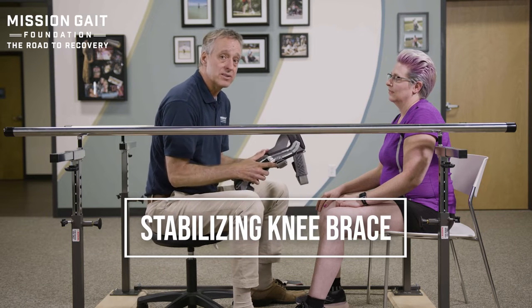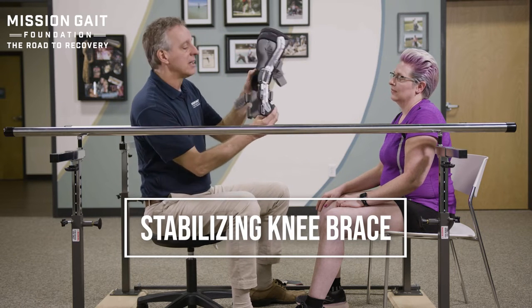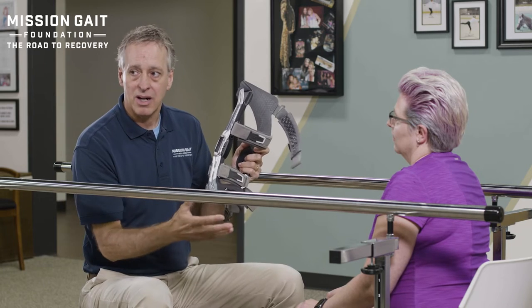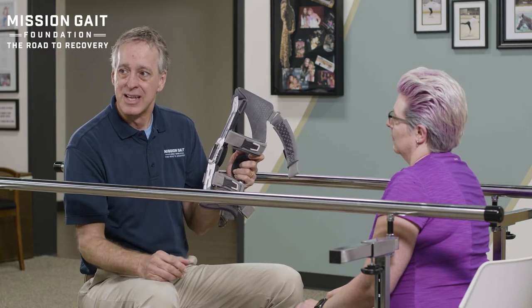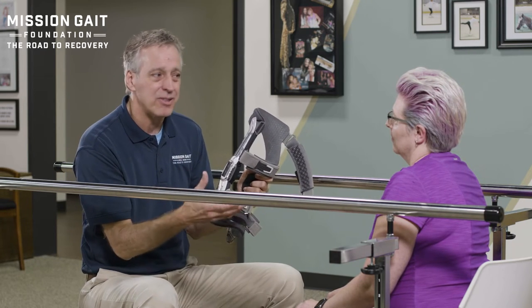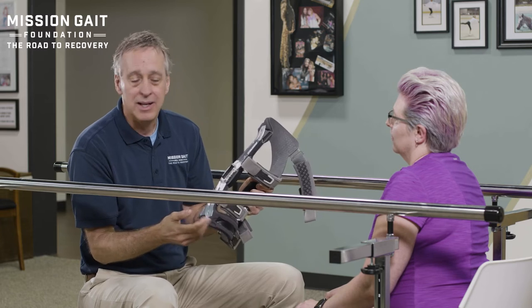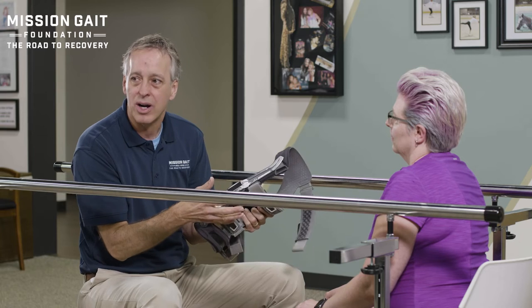We get started with first fitting the brace. In a frame brace — a very stabilizing brace with lots of straps — it can be somewhat confusing to the patient. I like to first explain the brace to them. We're not going to talk about product names here, but normally I would, because I want the patient to understand this isn't just a thing stuck on your leg. This is a brace you're going to be using — you want to know this brace, know how to use it, adjust it, and put it on correctly.